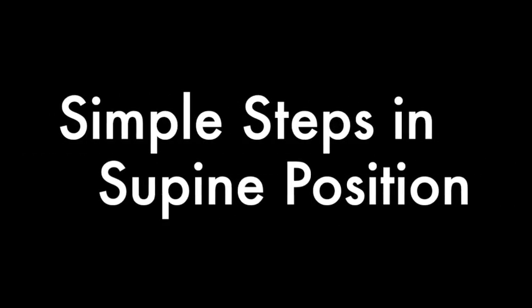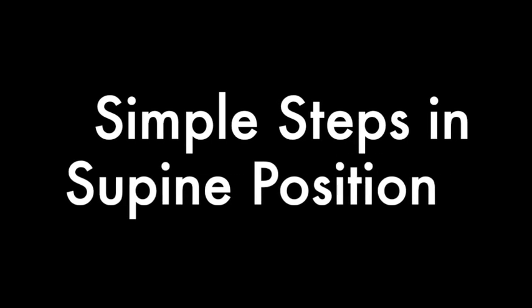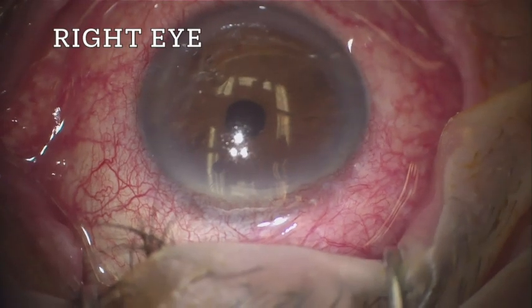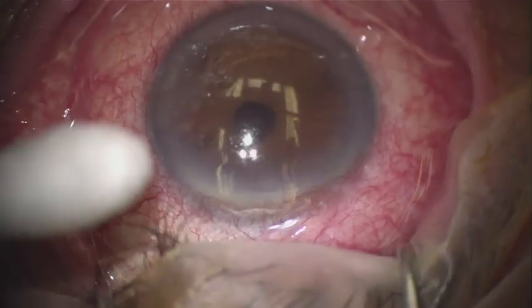Let's go over the steps of the procedure for an approach in a procedure room where the patient is lying supine. In the right eye, a lid speculum is placed in the eye and it is given topical proparacaine.